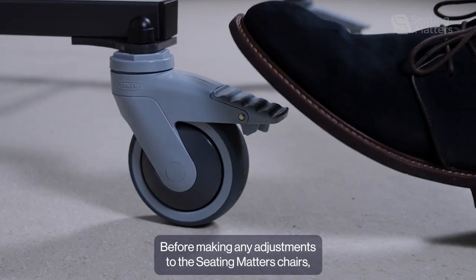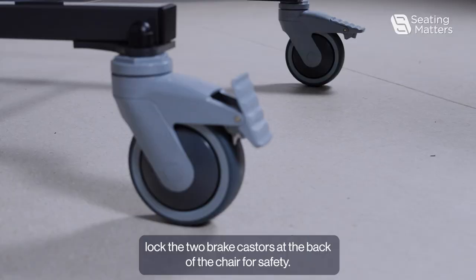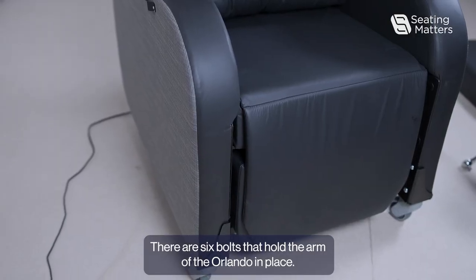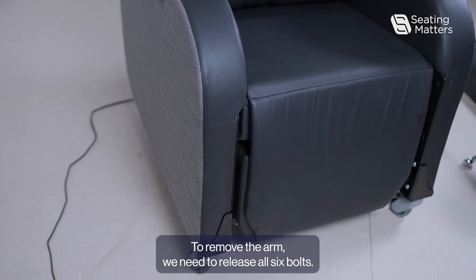Before making any adjustments to the Seating Matters chairs, lock the two brake casters at the back of the chair for safety. There are six bolts that hold the arm of the Orlando in place. To remove the arm, we need to release all six bolts.